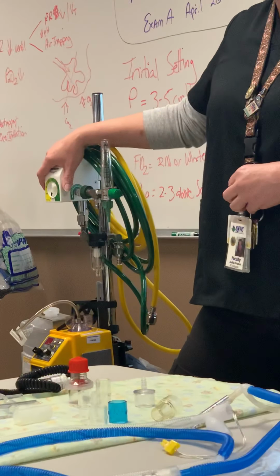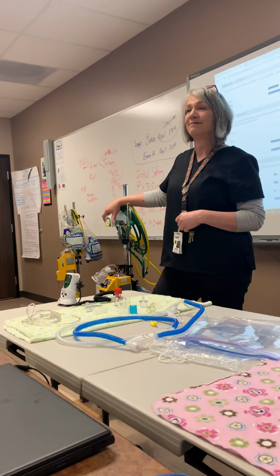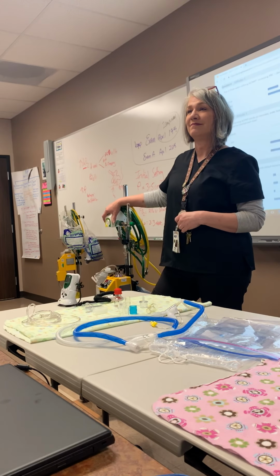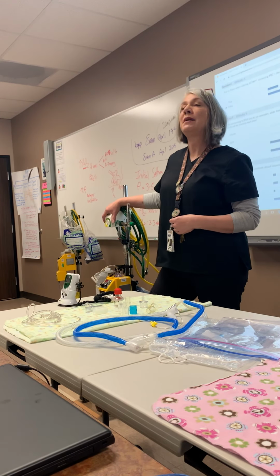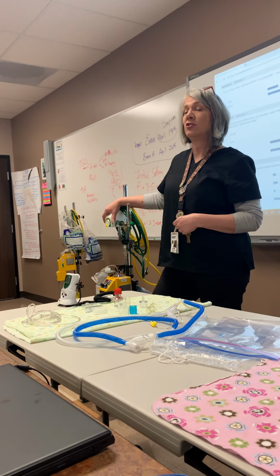Phil, I want to make sure you're clear. What's your question? I'm still kind of thrown off about the initial setting, because if you're putting a baby initially on a CPAP, don't you start up there? So you don't start with the initial setting. When a baby is on Vapotherm or high flow nasal cannula of 8 liters, how much oxygen are they on? 52.